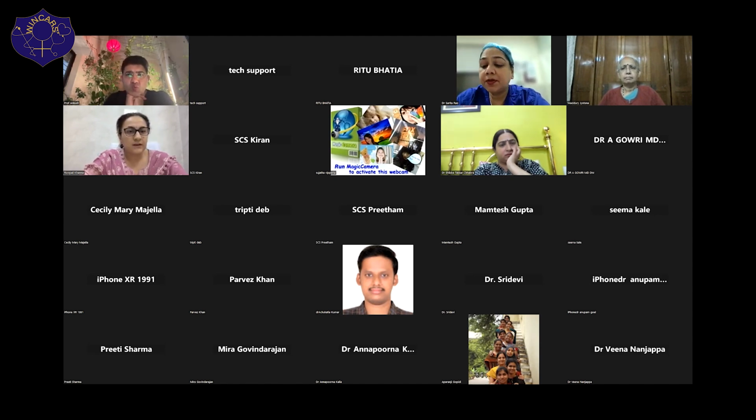Correct. Dr. Rupali, given a choice, I think most operators in a CKD patient, if they have IVUS and OCT both available, would upfront choose the IVUS. Also because when you take the pullback with the IVUS, generally the patient remains very stable. Whenever you give forceful injections using the OCT, many a times there are problems, especially if you have a vulnerable lesion at that point. Many a times when you give repeated forceful injections, the patient crashes also.